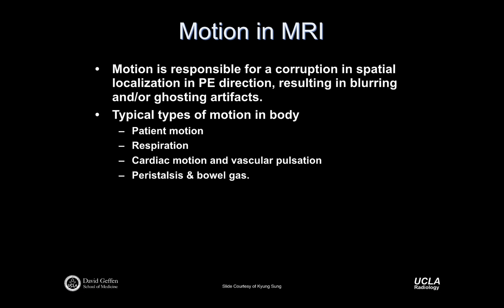ECG, right? So we can put ECG leads on your chest, and then we can tell the scanner to do certain things right when the ECG comes through, or with some time delay. So there's an easy way of synchronizing. Turns out that's not a completely perfect system. It works quite well, but it's not entirely foolproof. But we won't get into that too much.